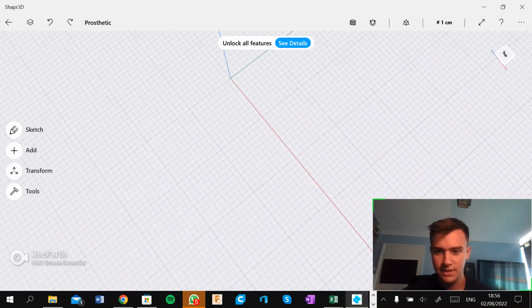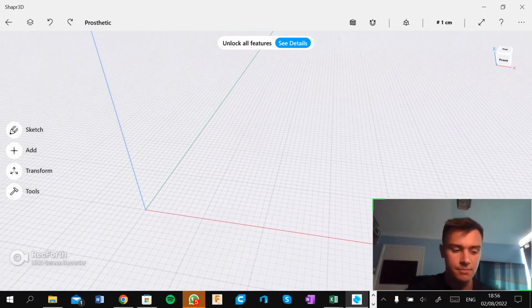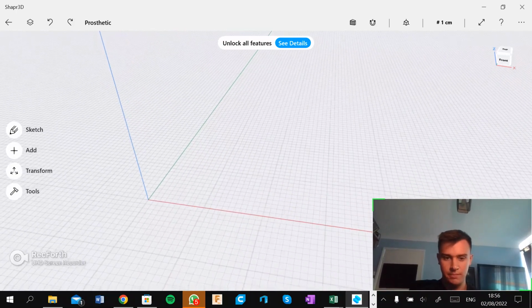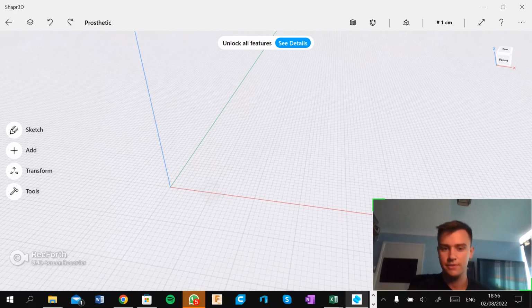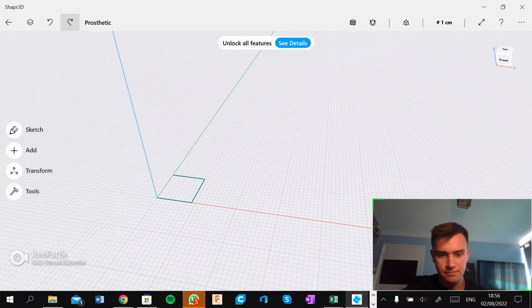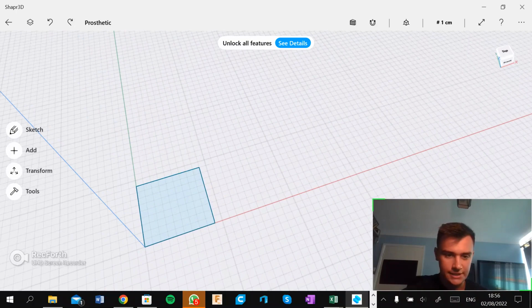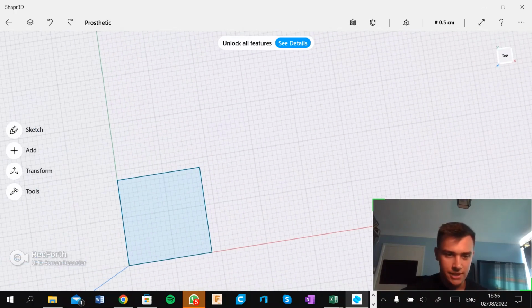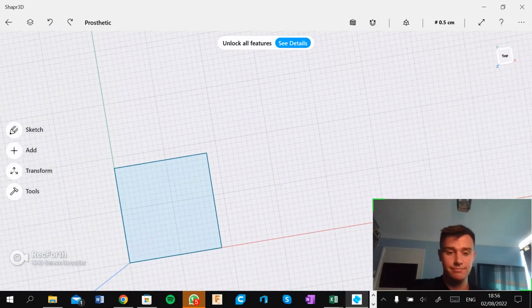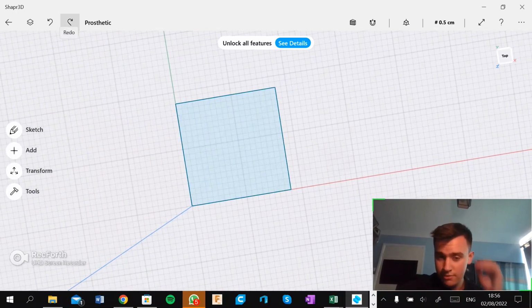So this is the Shapr3D here, and I use mine with the Lenovo Smart Pen, which has been the easiest I've found so far. And there we go. Okay. So I started off just by making out the rough design, roughly I believe a 9 by 9 centimeter square, and then we'll just see how I kept going from there.